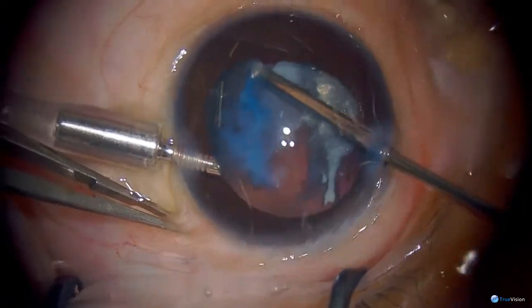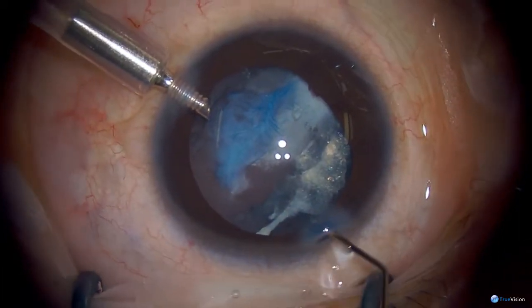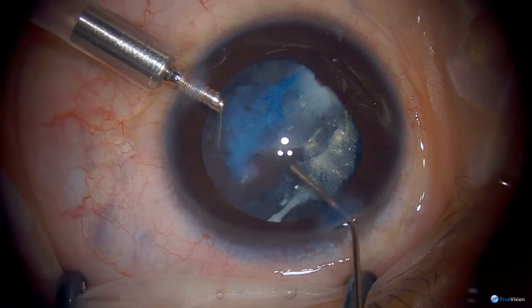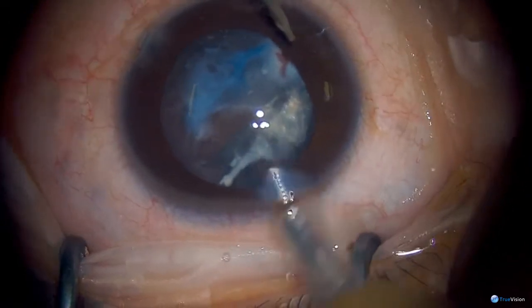Can I get the viscoelastic, please? Yeah, now you can turn it off, okay? As it's turned off, I just place a little bit in there, and then it just stabilizes it. So again, I don't like to have the chamber shallow.